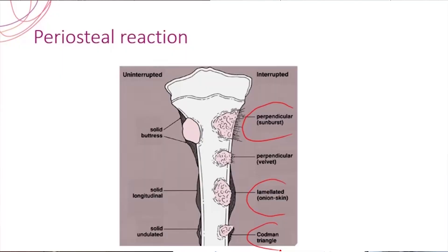As in the case of osteosarcoma, when it creates the sunburst appearance, it is trying to lift the periosteum at the edges, giving a classical Codman triangle appearance — again a classical feature of osteosarcoma. The periosteal reaction being interrupted in another axis can be lamellated — multiple periosteal reactions happening one over the other. A lamellated or onion-skin pattern periosteal reaction is seen, which is a classical feature of Ewing sarcoma. So whenever a periosteal reaction is interrupted, the possibility of being malignant is high.